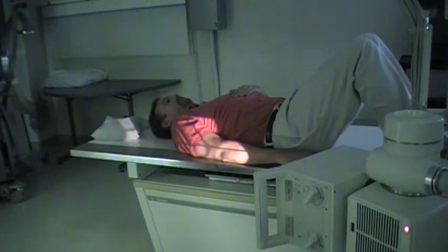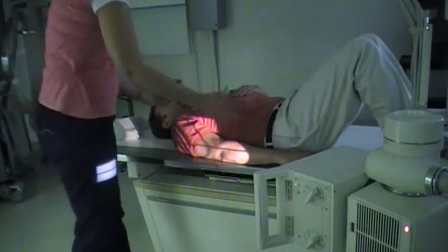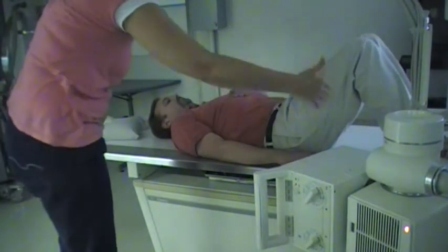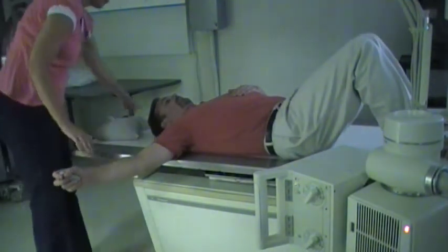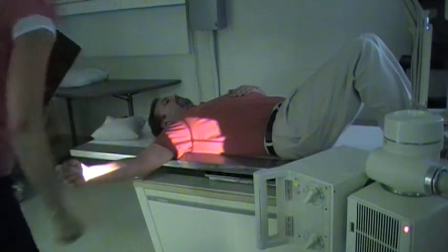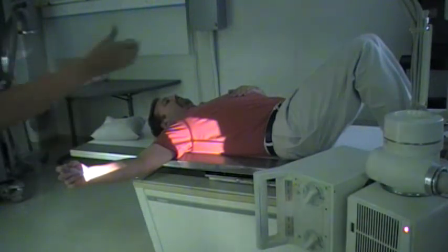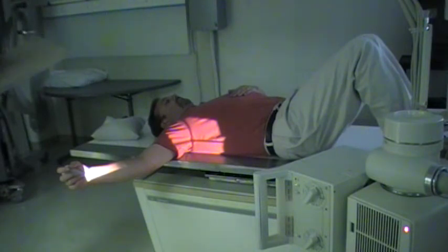We're going to do the inferior superior projection of the shoulder joint, also known as the Lawrence method. Bring your tube down beside the table and pull the patient's arm out from the side so that the central ray is shooting up directly into the armpit. This is often known as the axillary projection, but the central ray is going in inferior and exiting superior, so it's also known as the inferior superior.